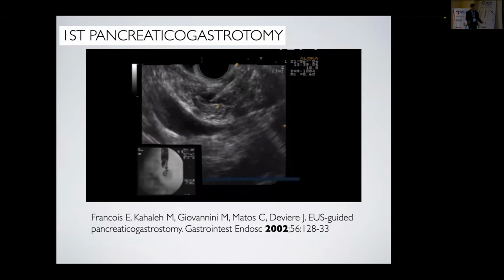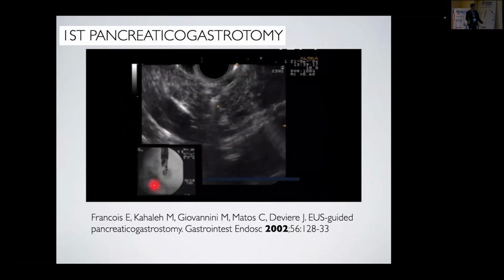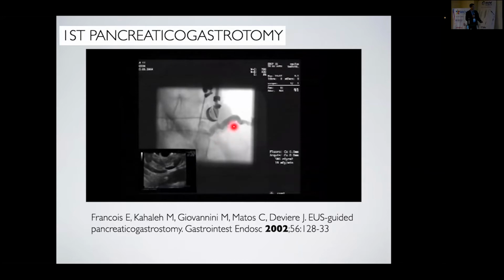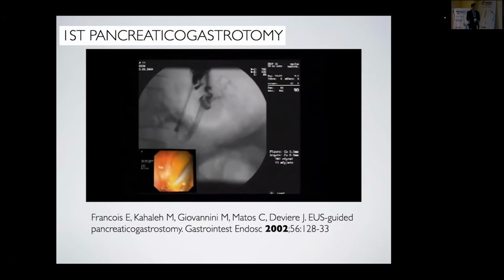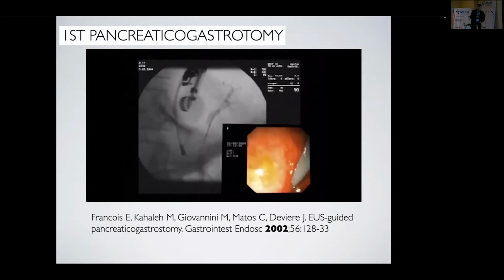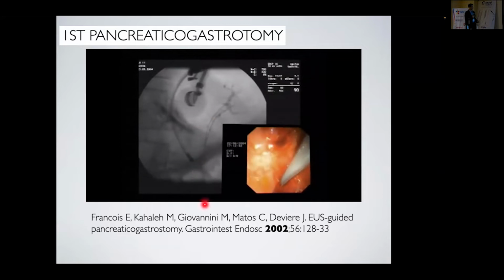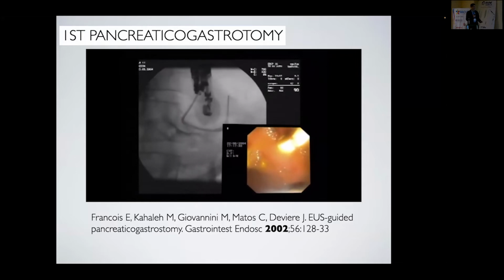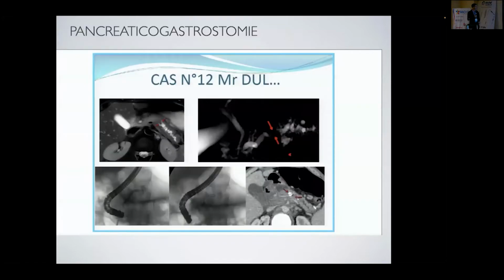and then he could opacify the pancreatic duct, and it is not well placed because you see the main part of the pancreatic duct is behind, so he has to place the wire on a loop behind him. He used at the beginning a huge cystostome. Now we use the 6 French cystostome. He had not a 6 French cystostome at this time. And after using this French cystostome, he placed the first stent in pancreatico-gastrostomy.